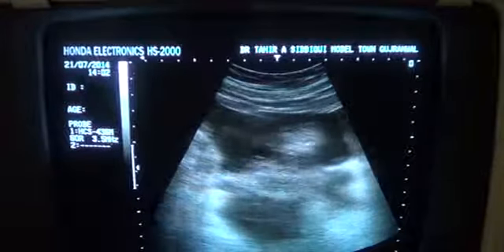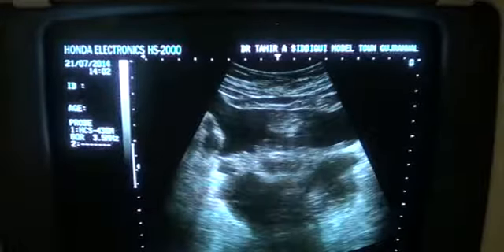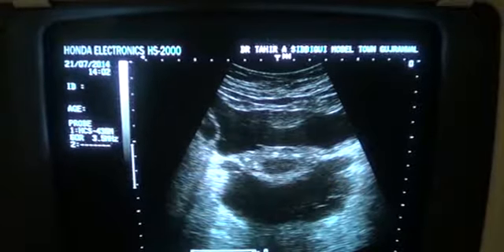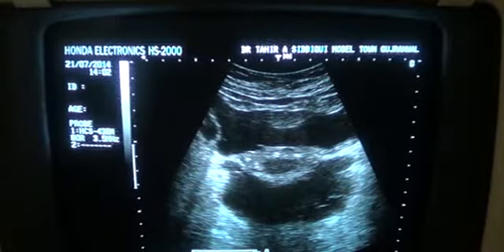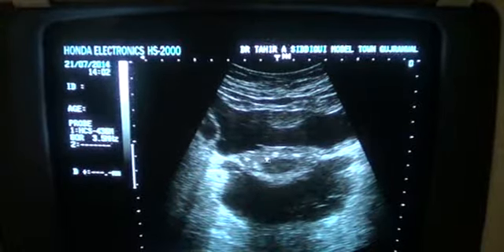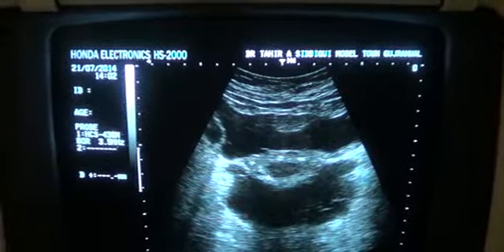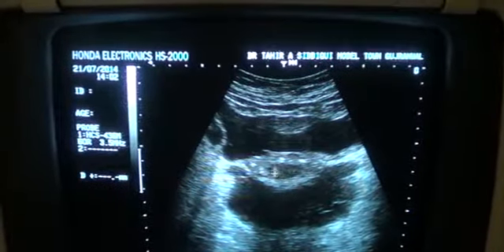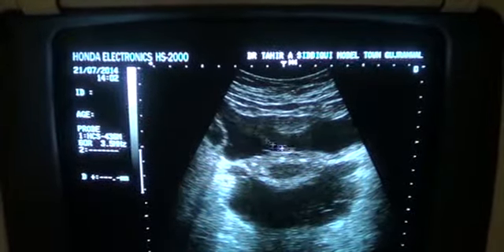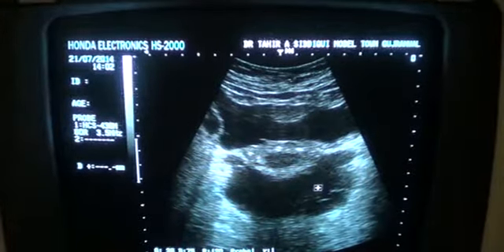Now this is the transverse section of the ascitic fluid. This is the uterus in transverse section, postmenopausal, tiny calcification seen. This is the transverse section. This is the central endometrial canal. This black area is all ascitic fluid. Thank you very much. This is the case of our day. Thank you.